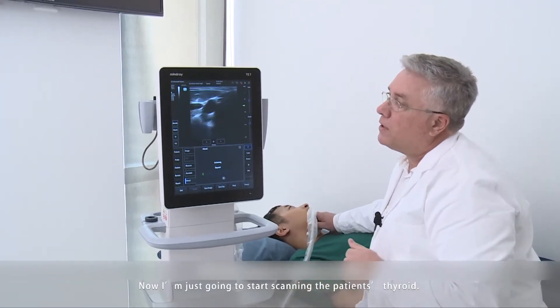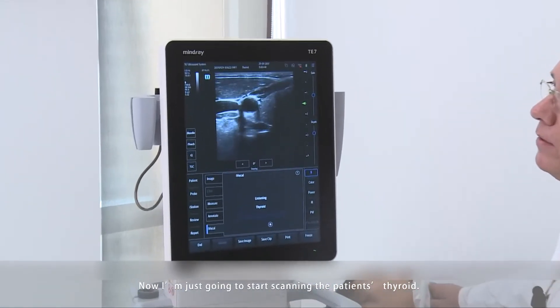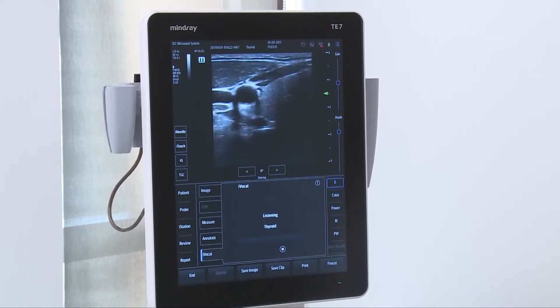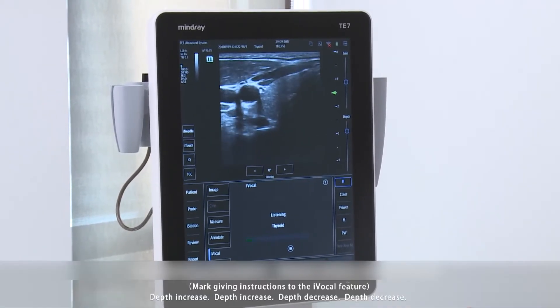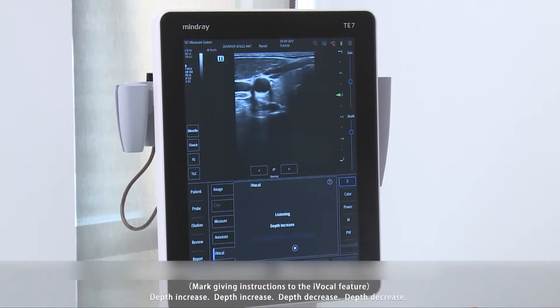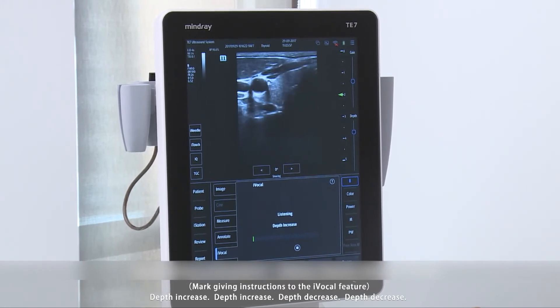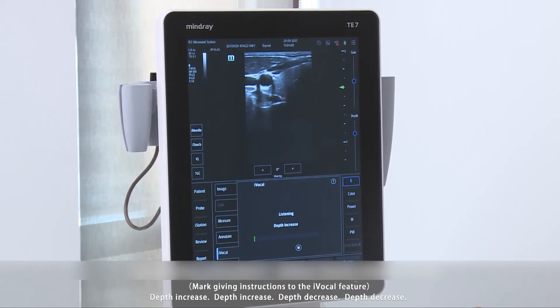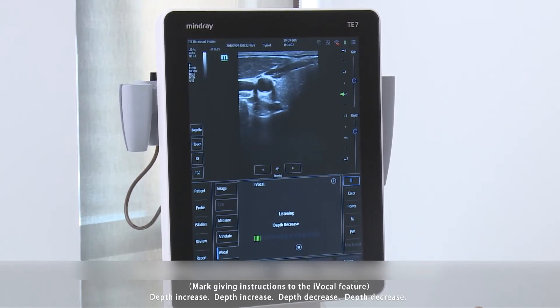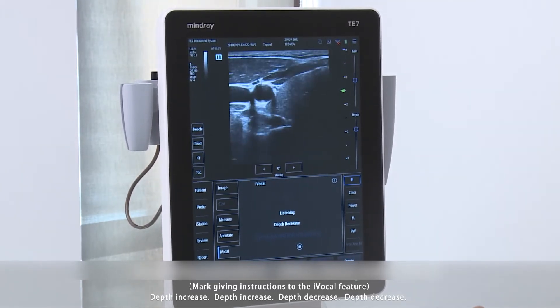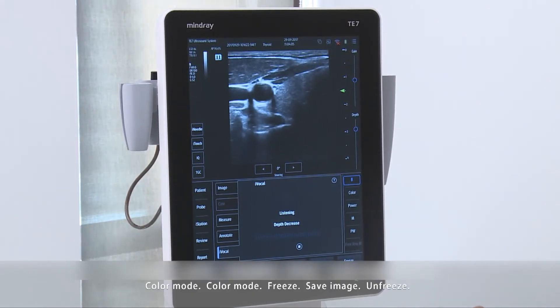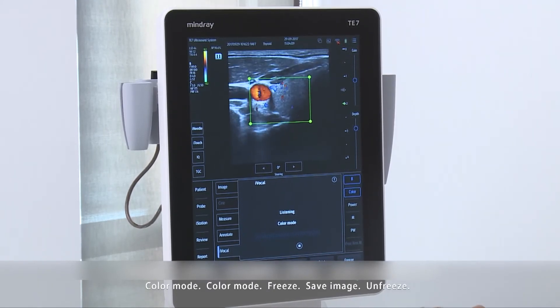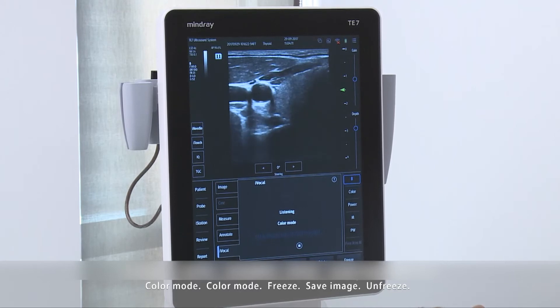Now I'm just going to start scanning the patient's thyroid. You can issue voice commands such as 'Depth increase', 'Depth decrease', and 'Color mode' — the system responds to each command in real time during the scan.